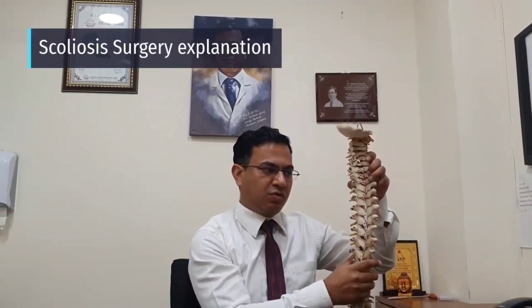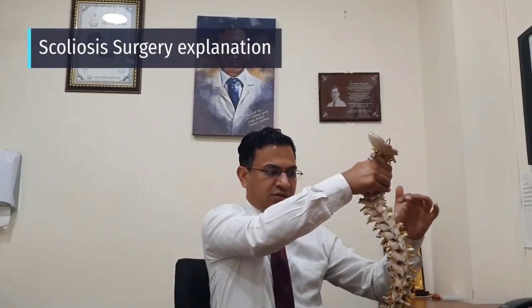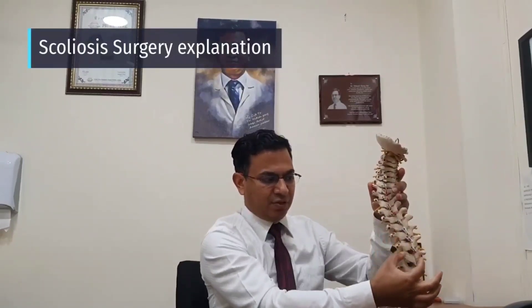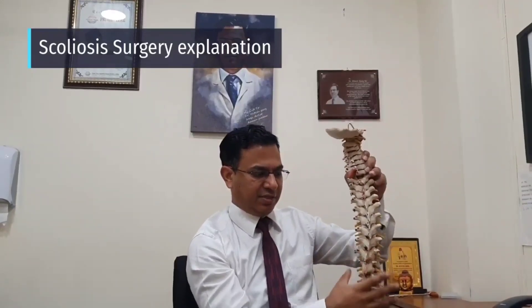Normally the spine is straight. In scoliosis, the spine gets crooked like this. In scoliosis surgery, we put multiple screws here and connect two straight rods. When you connect the rods, the spine gets straight.